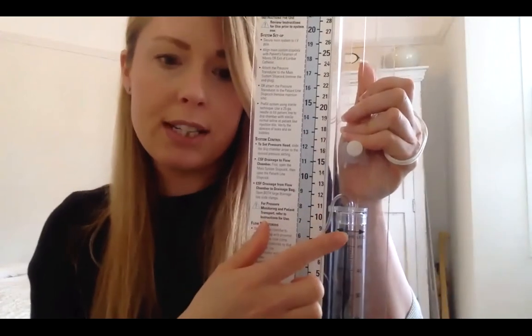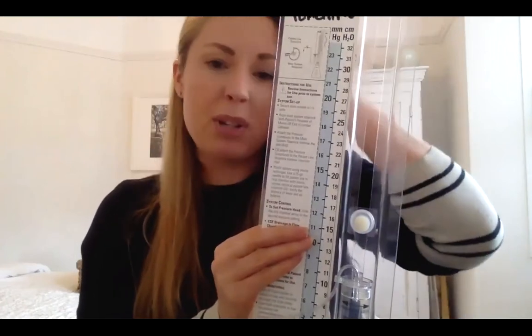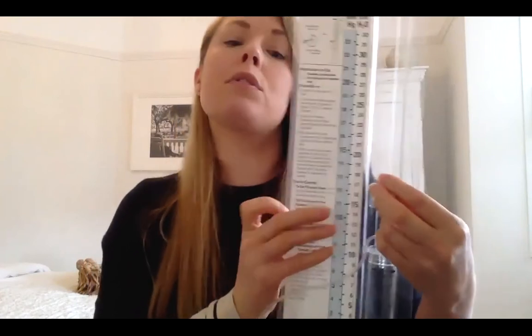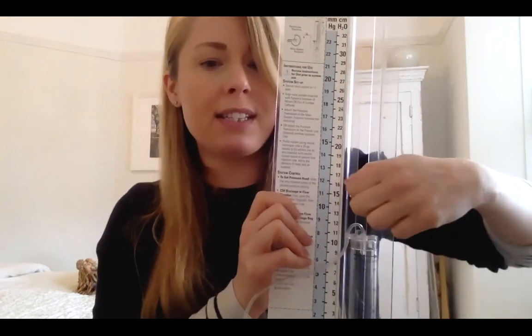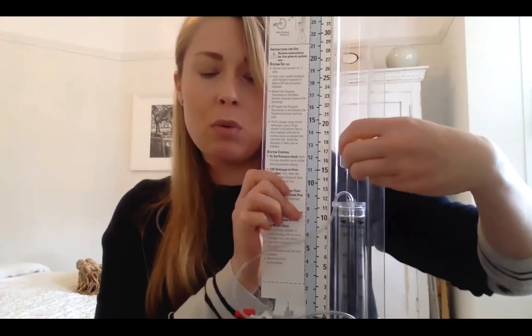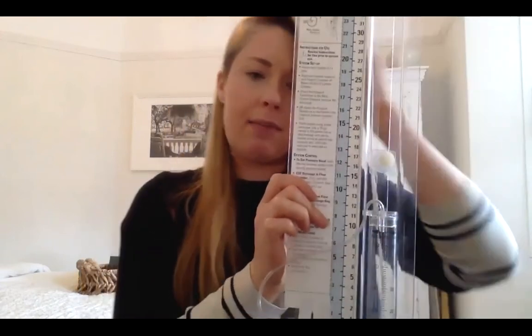And so you can see the black arrow, and it's not our job to change it, because if the neurosurgeon's coming around to prescribe a change in the EVD level, they can do that themselves. But it's very simple to do, almost too simple, which is why if this isn't tight enough, you can see how this chamber can slip up and down quite easily. But essentially that black arrow will be levelled with whatever EVD level they've decided to set it at.